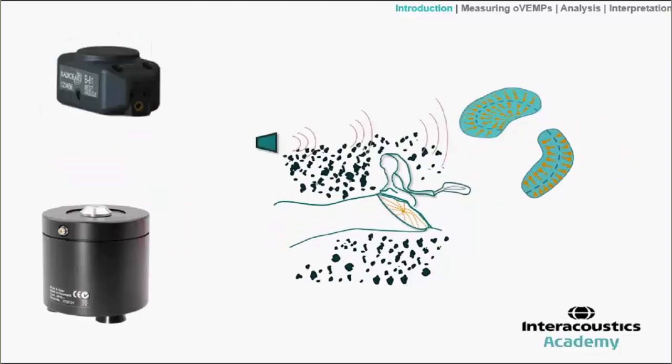And then this slide shows the typical or hypothetical route by which bone conducted vibrations can propagate through the temporal bones if the transducer is placed on the mastoid, but it's not the only place that a bone vibrator might be positioned. But you can see here those sound vibrations entering the ear from a slightly different angle, but again causing a complex pattern of both utricular and saccular activation.